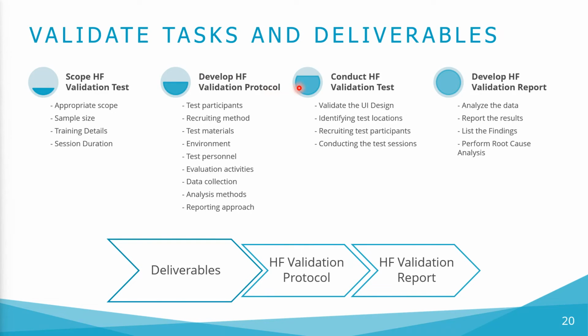Conduct HF validation test. This step is pivotal. The HF validation test will determine if a representative sample of the product's users can interact with the product in a safe and effective manner, thereby validating the UI design. The HF validation test will involve identifying test locations, recruiting test participants, and conducting the test sessions according to the HF validation test protocol.